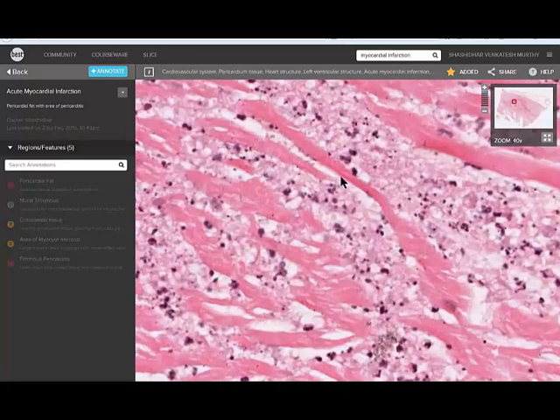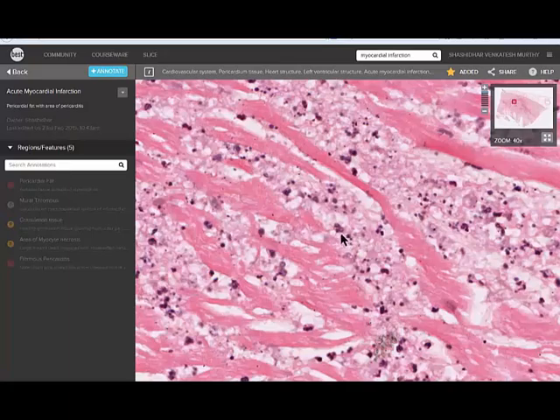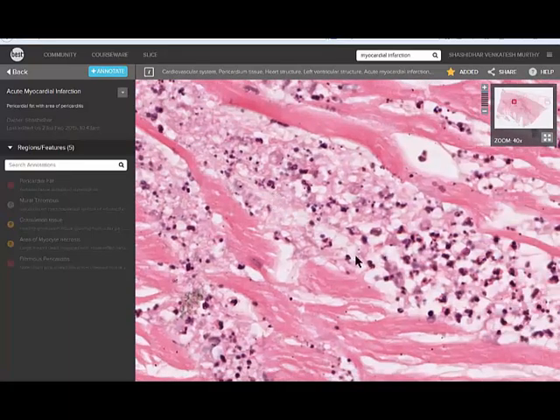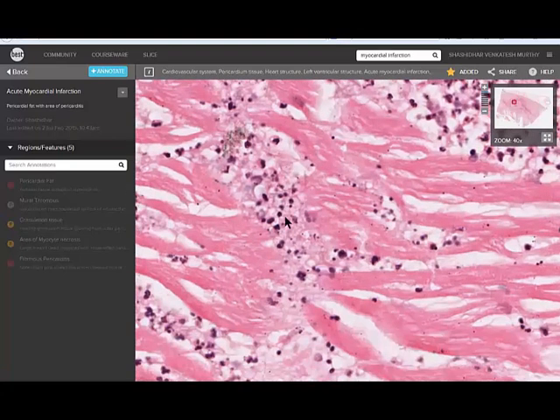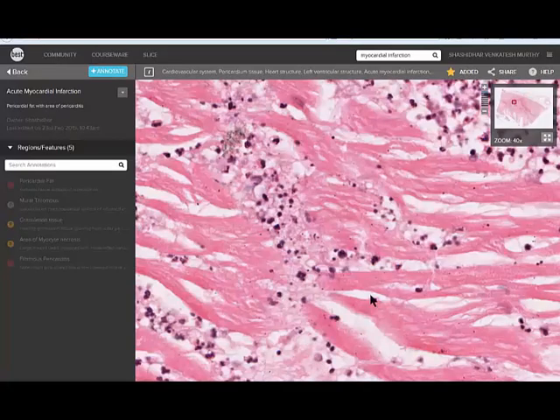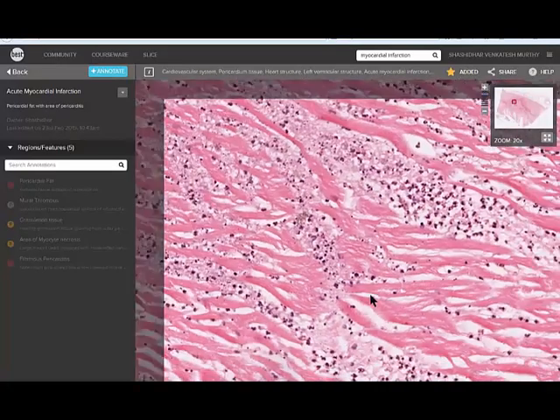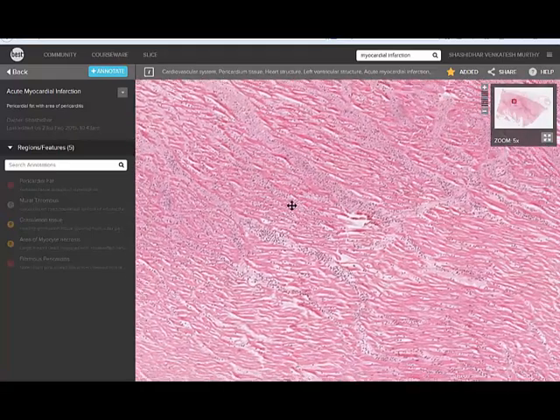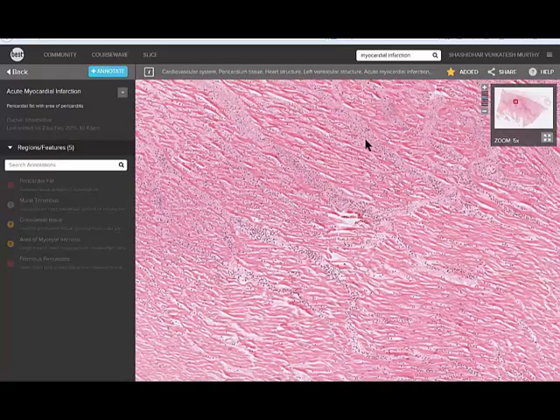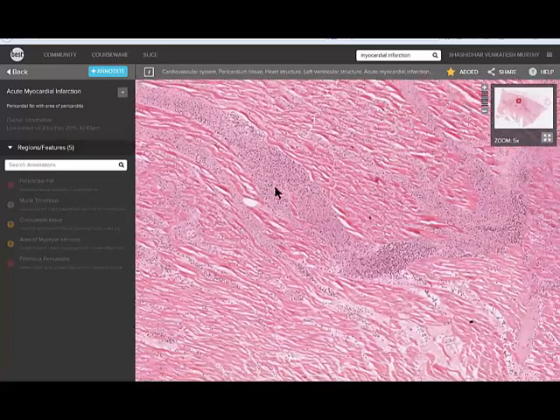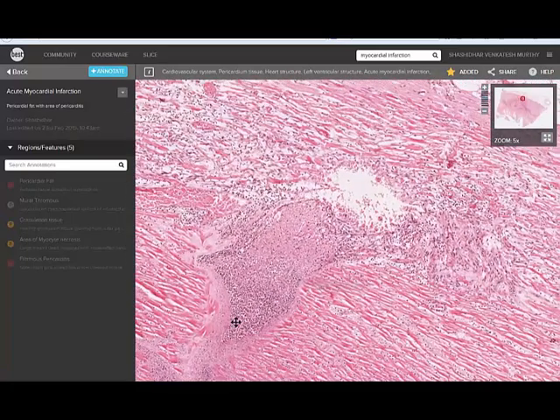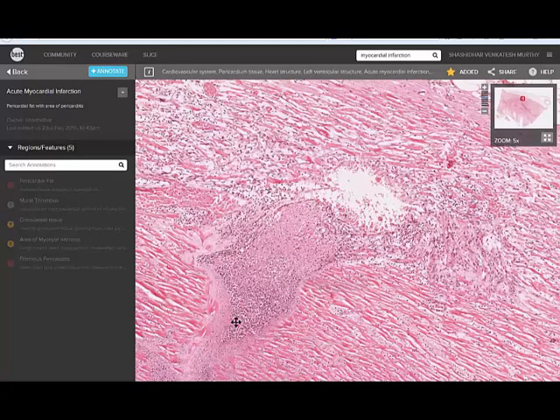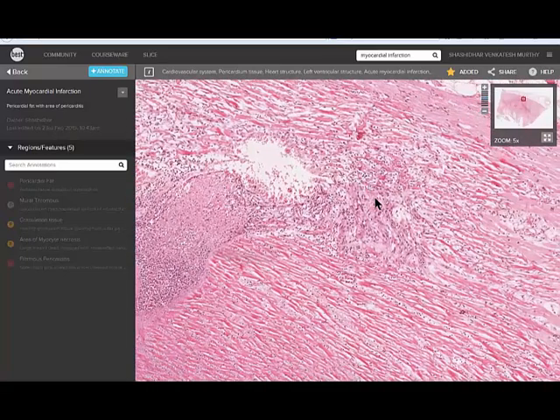The dead tissues show nuclear fragmentation, nuclei are just pycnosis, nuclear pycnosis. They are all dead cells with dying cells, debris. Most of them are neutrophils. They have lobed nuclei and they are literally eating away by proteases which are being secreted. There will be even macrophages as well. If we see areas now, low power view, you can see large areas of necrosis, large areas of necrosis replaced by dead tissue and as the days progress, usually after the third day starts is macrophage reaction.